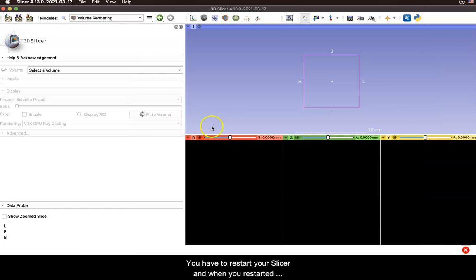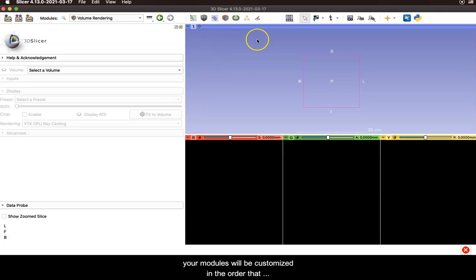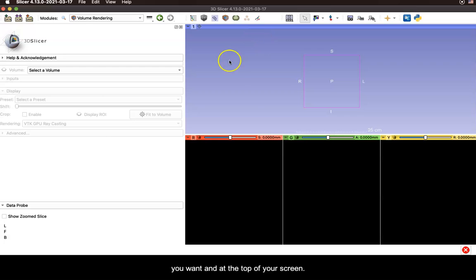You have to restart your Slicer and then when you restart it your modules will be customized in the order that you want and at the top of your screen.